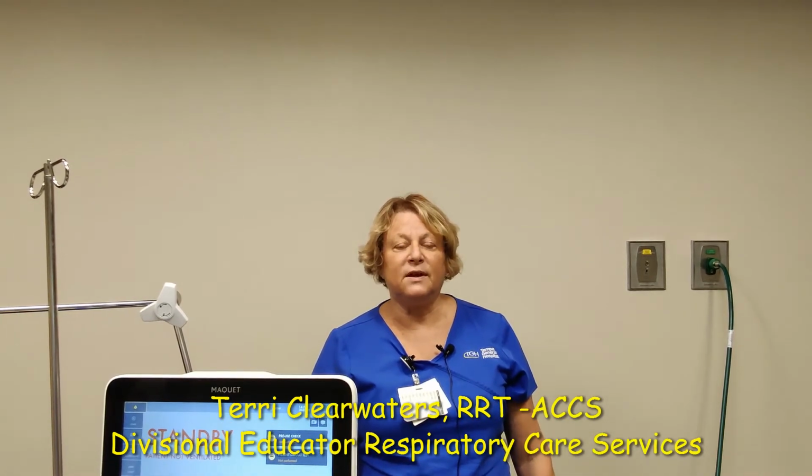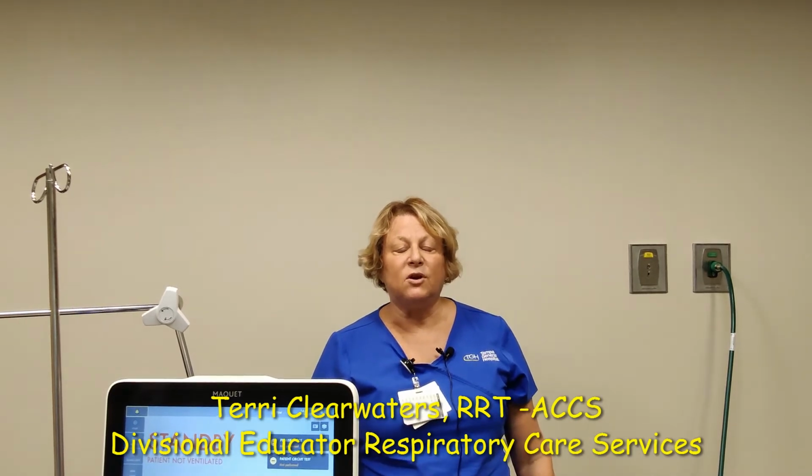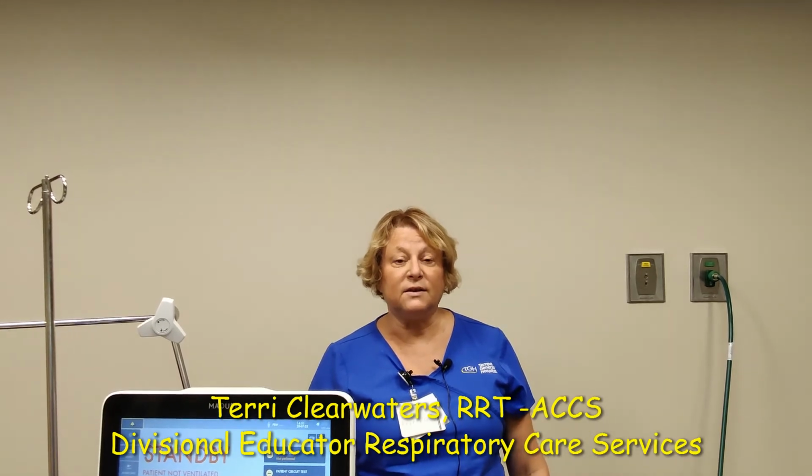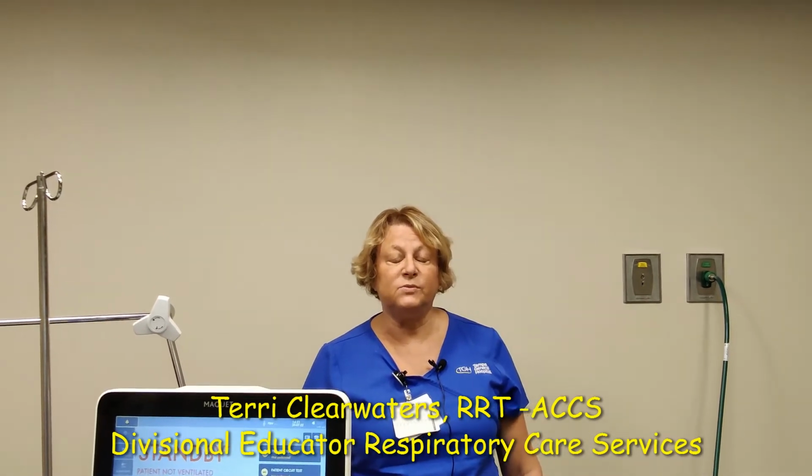The purpose of this video workshop today is to give an overview and educate on mechanical ventilator modes as they affect the lung, and for demonstrations we have it attached to a pig lung. You've already had your lecture from Dr. Jennifer Cox on the PowerPoint presentation on mechanical ventilation. So the purpose of this is to demonstrate and put in your adult learning mind how those different modes and that mechanical ventilator actually affect the human lung, and we're trying to demonstrate that today in a pig lung. So we're going to demonstrate different modes.